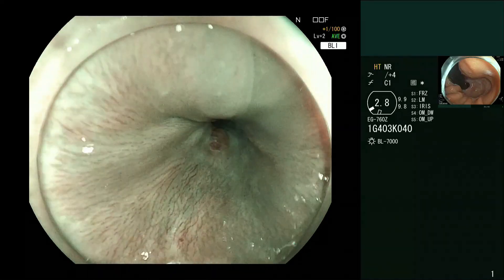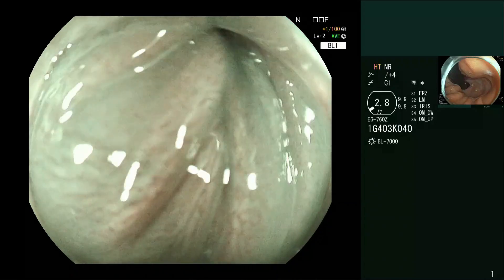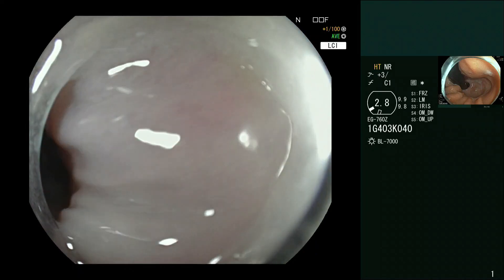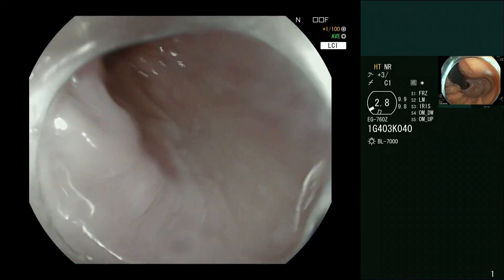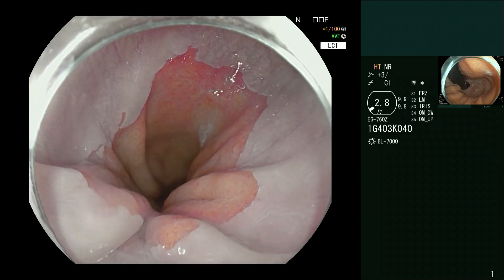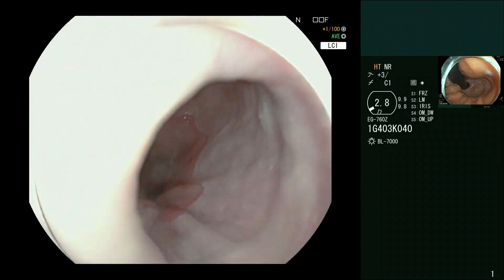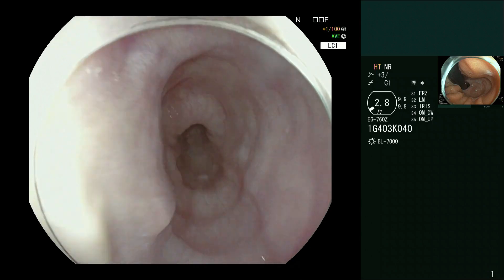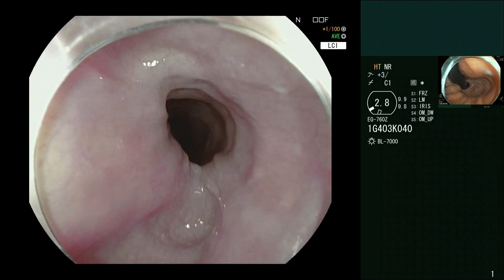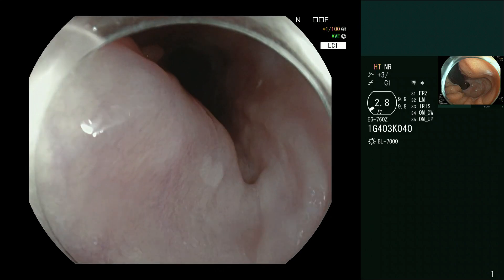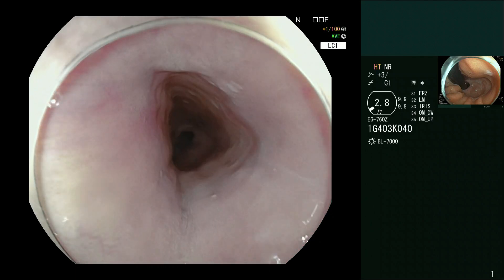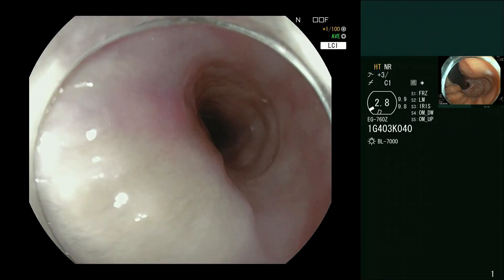We see an inlet patch, not much else. We can do it once more with LCI — linked color imaging — to make the point that this is also a detection mode. The point of this mode is for hypervascular areas to stand out more. You see the hypervascular nature of that part of the gastroesophageal junction. We see the clip artifact standing out beautifully in LCI. This is a squamous papilloma of the esophagus, of no real clinical relevance.